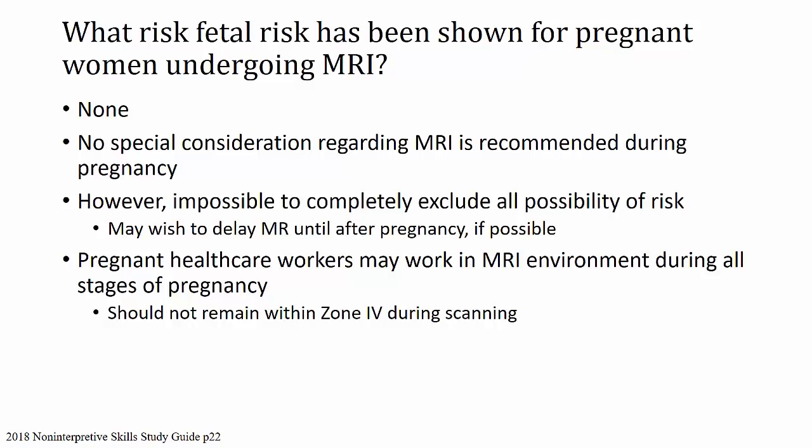And so, in general, again, this is somewhat controversial, but for the most part, no special consideration regarding MRI is recommended during pregnancy. However, of course, it's impossible to completely exclude all possibility of risk, so you may wish to delay the MR until after pregnancy if possible. And when it comes to pregnant healthcare workers, they are allowed to work in the MRI environment during all stages of pregnancy, but it's recommended that they not remain within zone 4 during scanning.